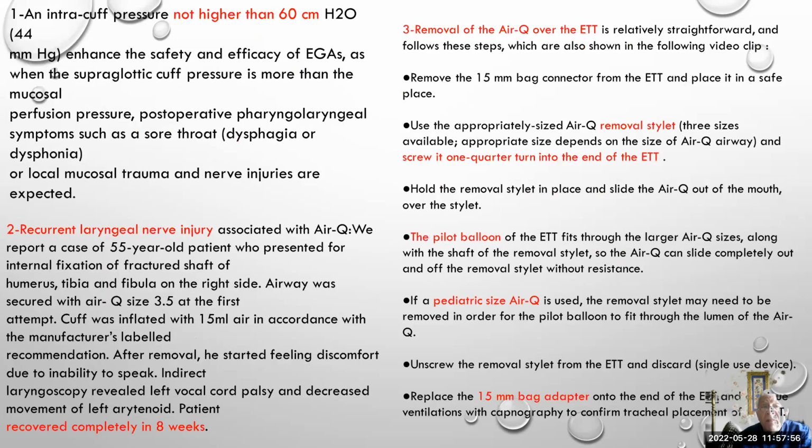Of course, the supraglottic devices were utilized by novice doctors to try to compare different types, how easy the introduction of the devices is, and use. They used a cervical spine injury simulator to assess the best supraglottic device whenever we have injury of the cervical spine. Some authors claim that this laryngeal mask may obstruct the carotid artery. So they used a gadolinium dye injected through this cuff to visualize it through the MRI, and they noticed that the spread of the cuff is away from obstruction of the carotid artery.